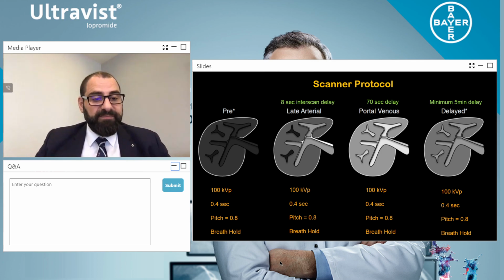Now, I've just been stormed by a lot of questions. Let me just go through them quickly. Okay, so from James Miro: from memory, LIRADS advises HCC and washout delays between 3 and 5 minutes. Should these still be done at 10 minutes, like what would be for hemangioma? Absolutely.